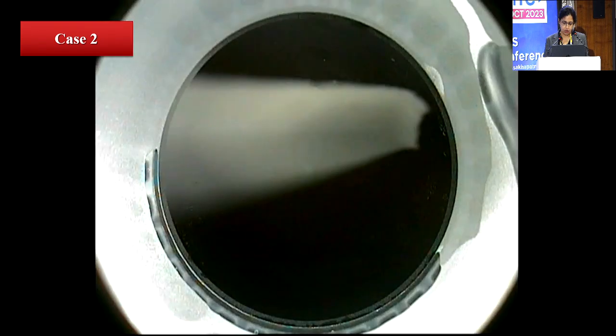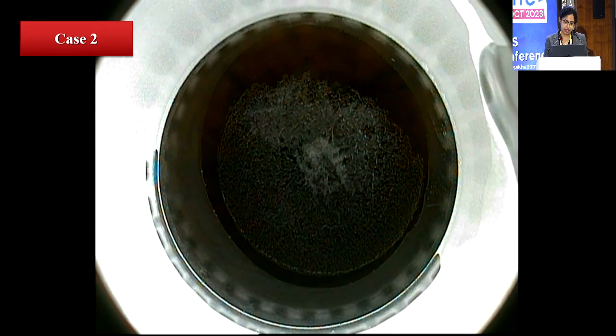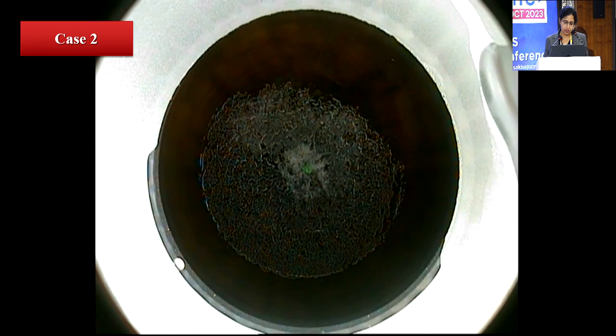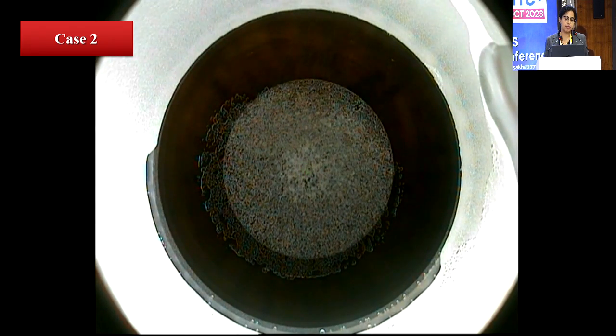Immediate redocking can be done, and you can clean the interface, and you can use the fixation green light and the central bubbles as relative indicators of maintaining the same centration as there was when you were initially trying to do the procedure. After that, you do expect a little bit of increased adhesions because of the opaque bubble layer. Dissection will not be as smooth as in primary cases.